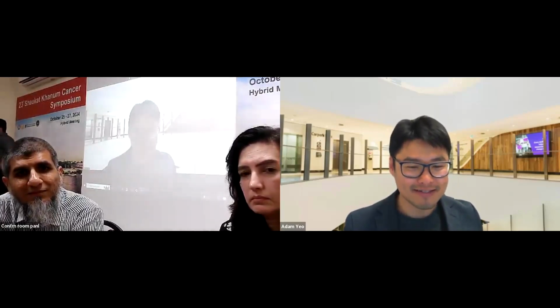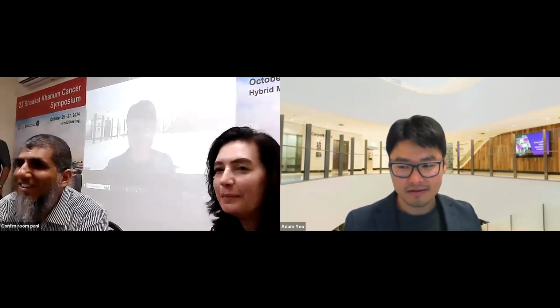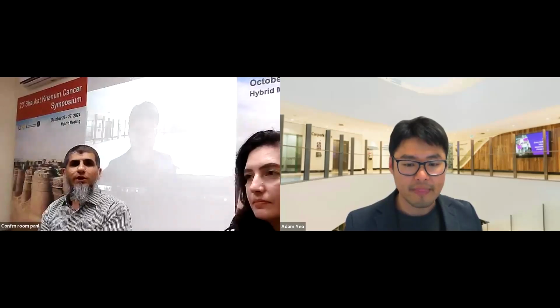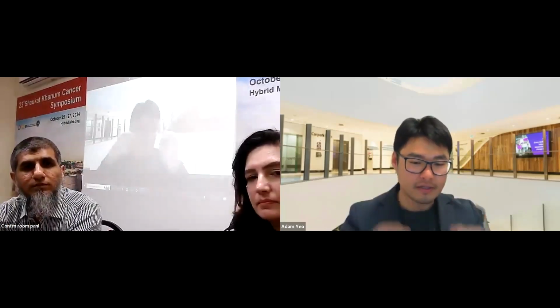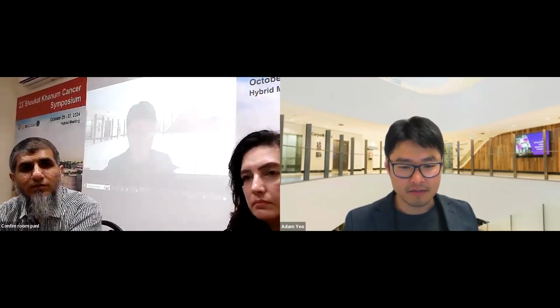So yeah, when we enroll, it's a standard practice. In principle, any new type of technique, we roll out first 20 cases, we measure everything. So if it's like 15 mets in single ISO, we have to measure all. But I see some of our physicists not being happy. But after we meet that requirement, let's say X number of patients, the X typically is 20 for us, then we reduce the number of measurements. We just pick the most modulated cases and then the smallest lesion, so we selectively choose only 2 or so. And if it's DCAT, dynamic conformal arc, there's no modulation, which is Elements' option, and then we really don't need to measure, it's just an open field with the arc. But if there's modulation, yes, we really need to measure at least the first X number of cases to confirm how our system behaves in terms of the modeling accuracy.